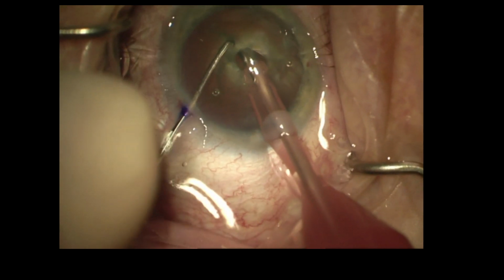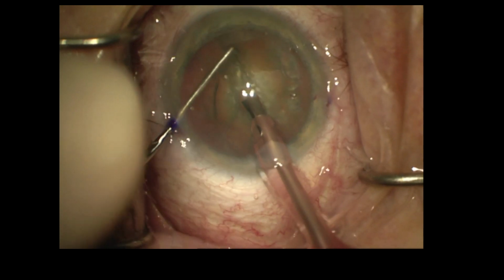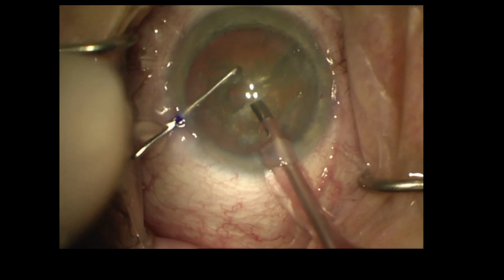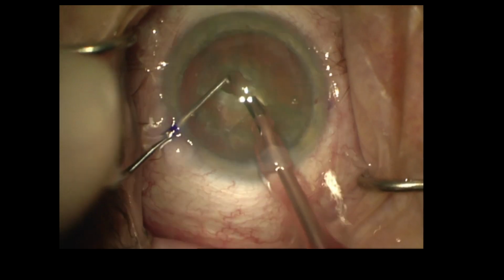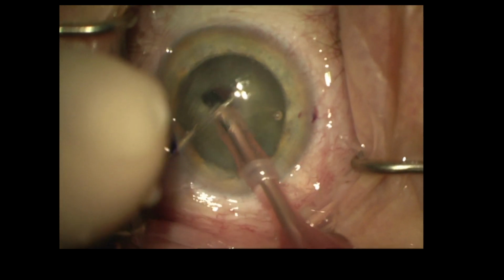The vertical chop is a very useful technique for hard cataracts. However, there are several nuances to this technique that make it not as straightforward as horizontal chopping. In this video, I'll show my technique for vertical chopping.